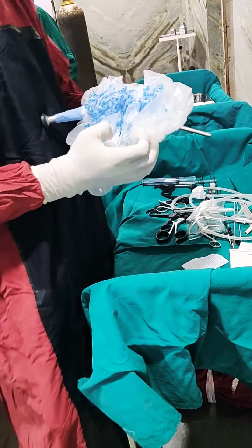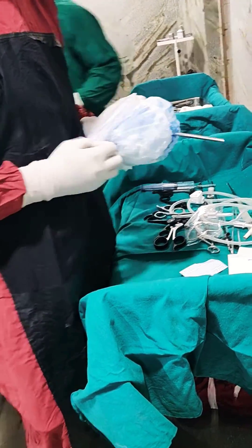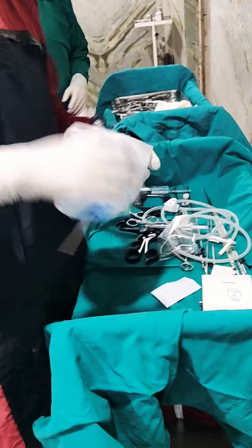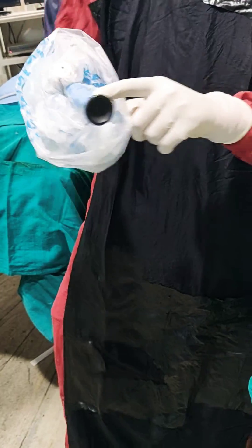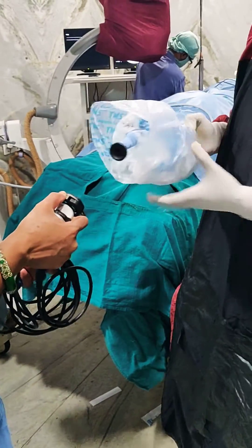This is the end of the sheet. I will turn it around. And this is how you seal. This will go into the camera and I gave this to the nurse — she will pull it.